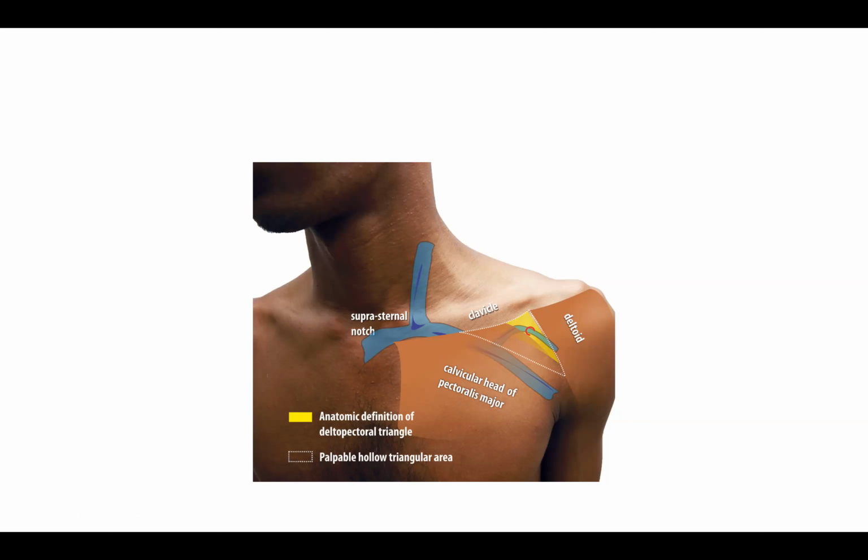Then, if you are the type that likes creating a pocket before getting an access, once you create that pocket and you want to get an access from the pocket, you have already created a depth. So you don't need to move that needle in any form of oblique.